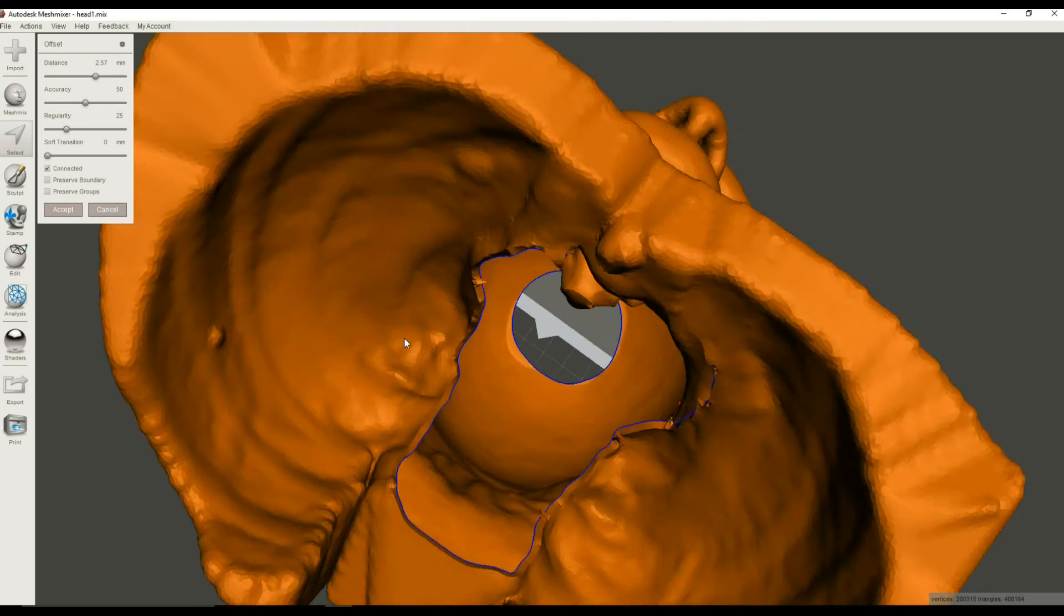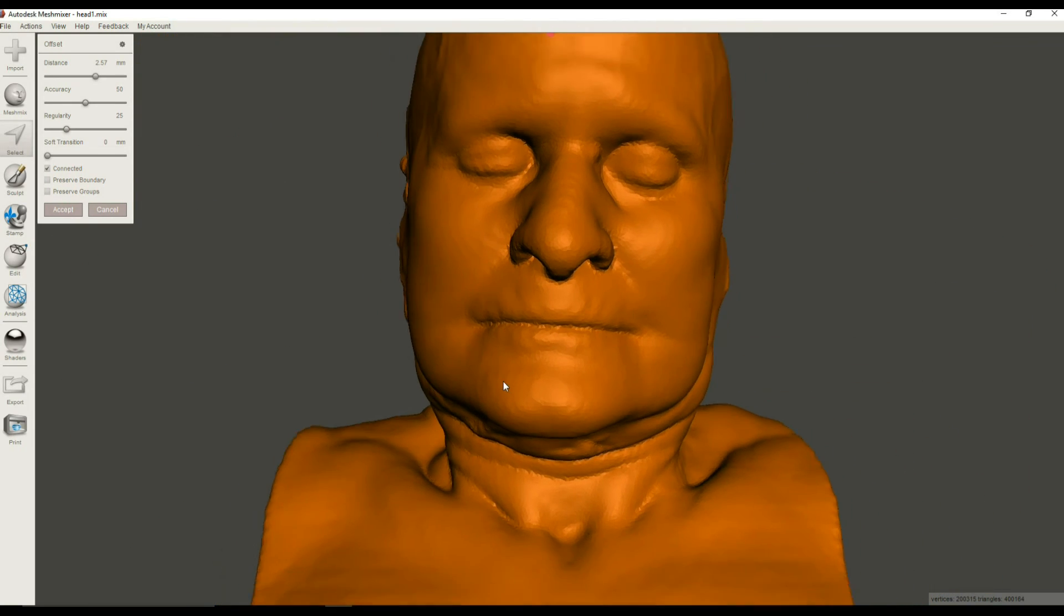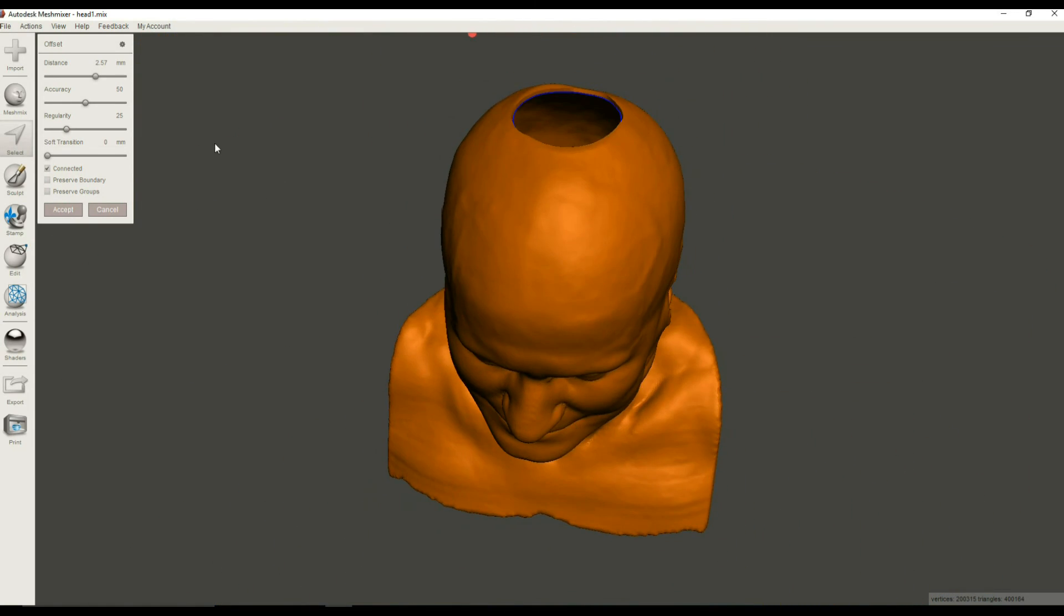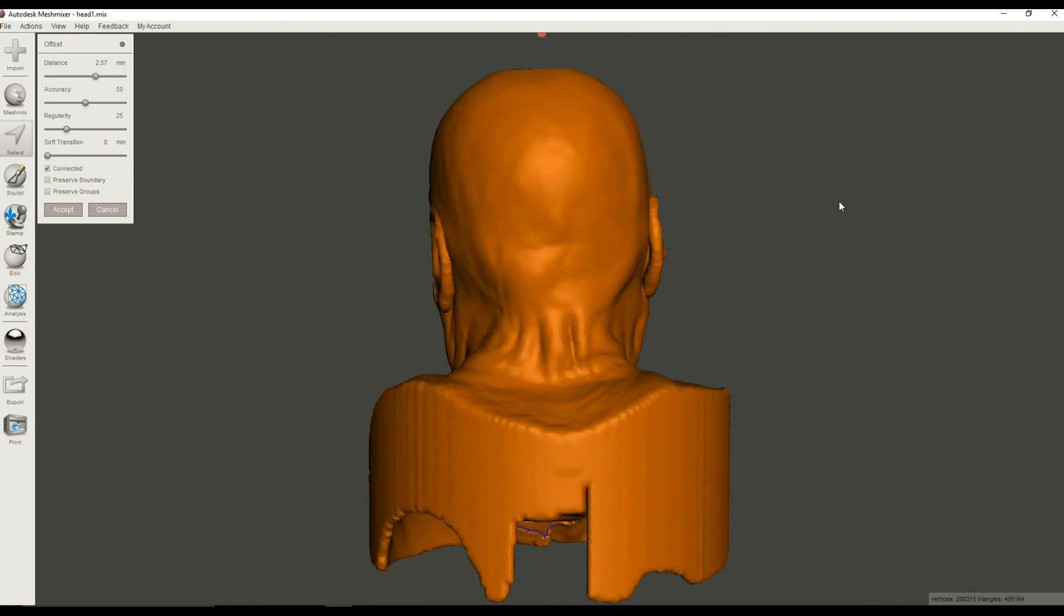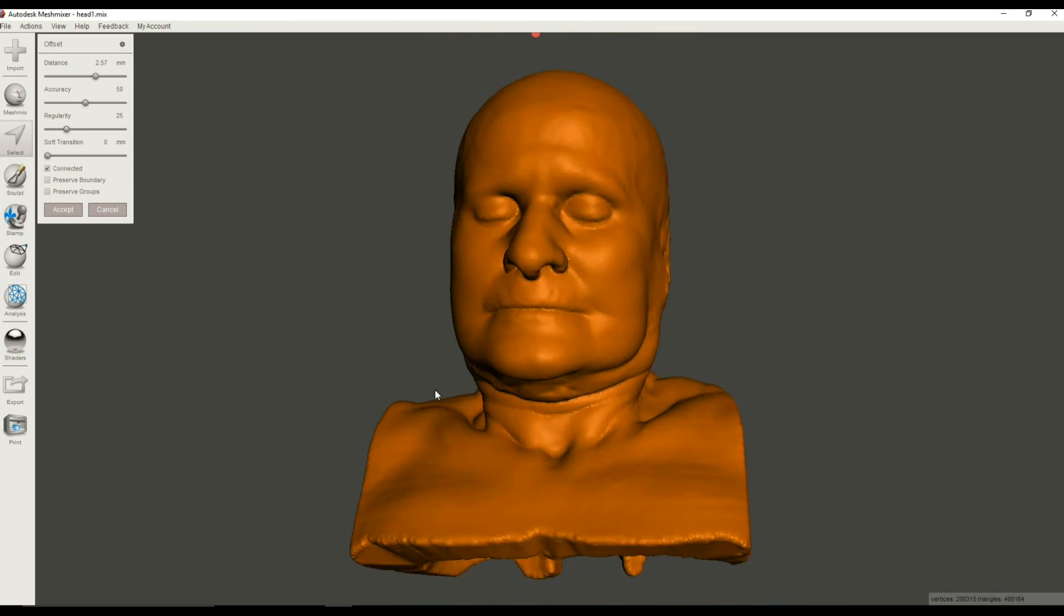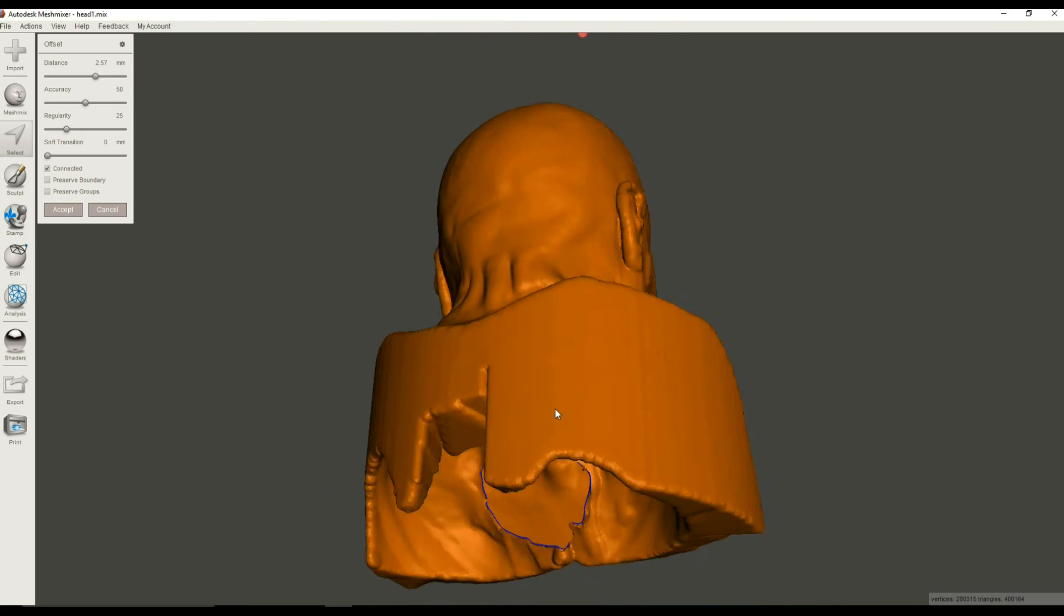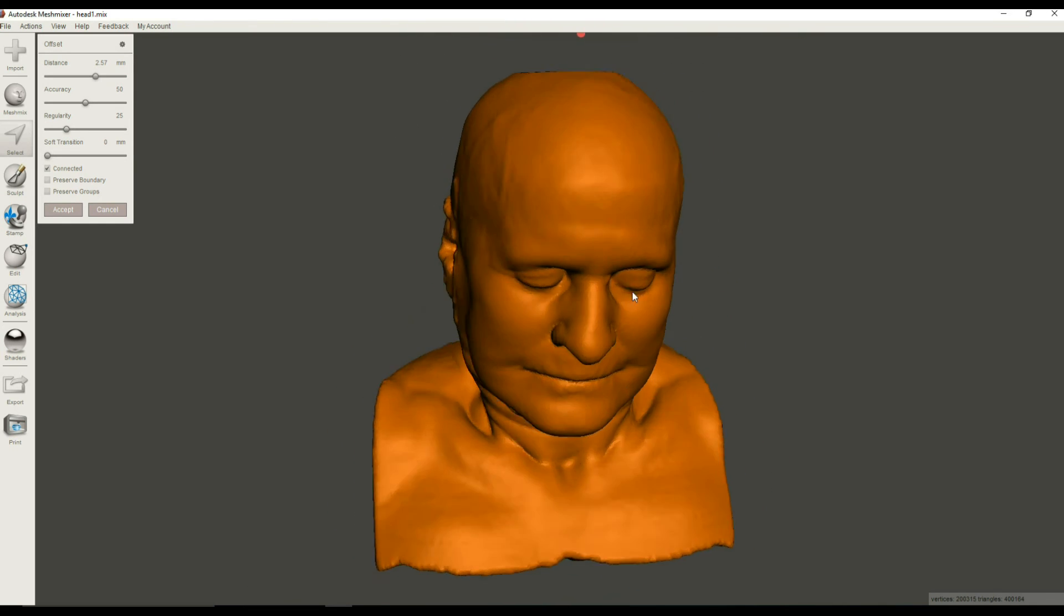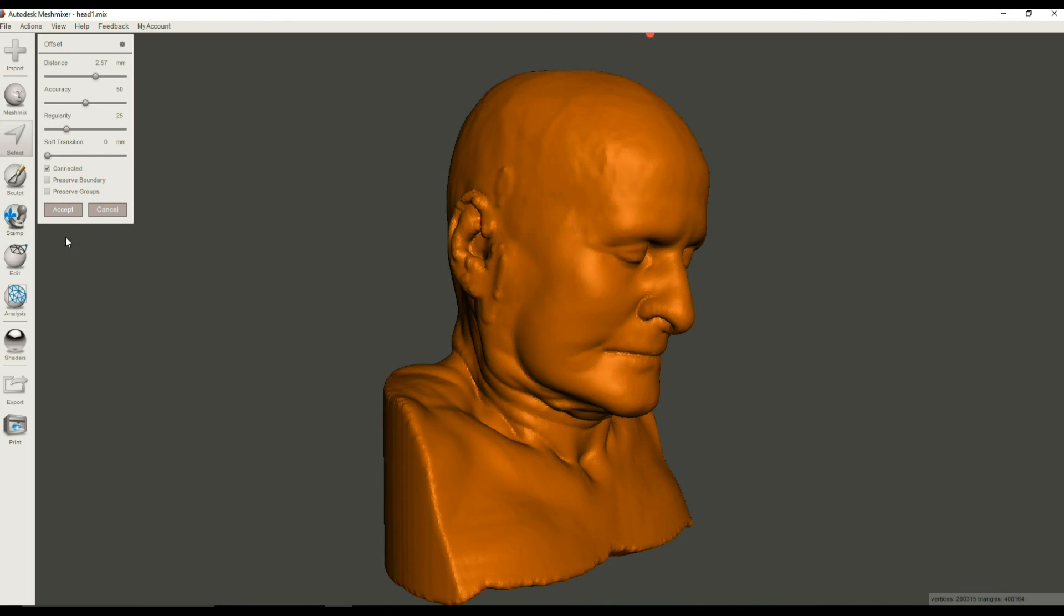And so now what we have is we have a shell that is one inside the other. This one is 2.57 millimeters. You can, of course, set this to whatever you want, depending on your printer or your desired thickness. But you have a perfect, perfectly thickened hollow replica of your original model. And we can go ahead and accept that.